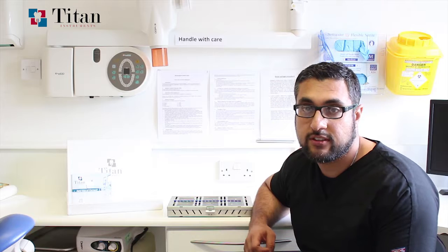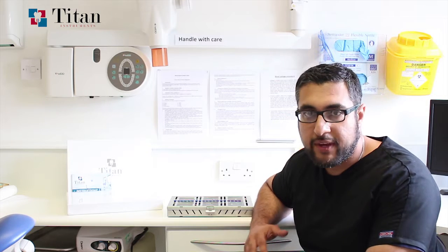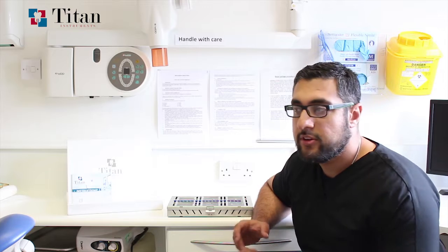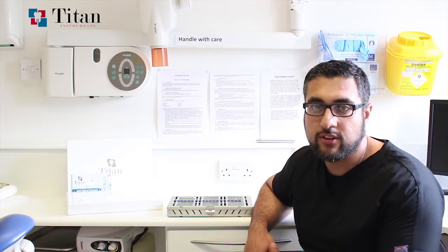I work at several different practices and found that there may be smaller surgeries and larger surgeries. You go to a larger surgery and see the setup where all of the hand instruments are laid out very nicely — spacing looks very good and the setup is very easy to use. But you go to a smaller surgery and find the instruments are very cluttered, making it difficult for the nurses to ensure everything not only looks nice but is also easy for the surgeon to pick up.